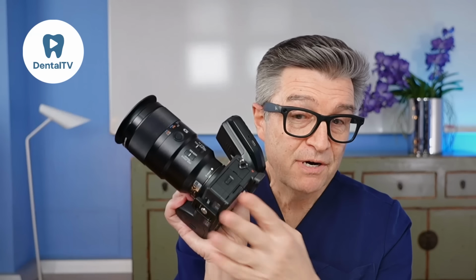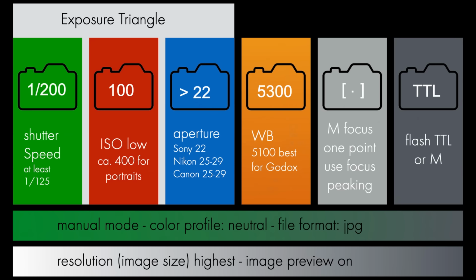Post-processing of your dental photos, a topic that I get a lot of requests. Before we start, I want to highlight something important. If you set your camera correctly, with the right settings, using the right equipment, having a constant reproducible setup, you don't need post-processing. Just change the settings inside your camera if you're not happy with the colors, the consistency.